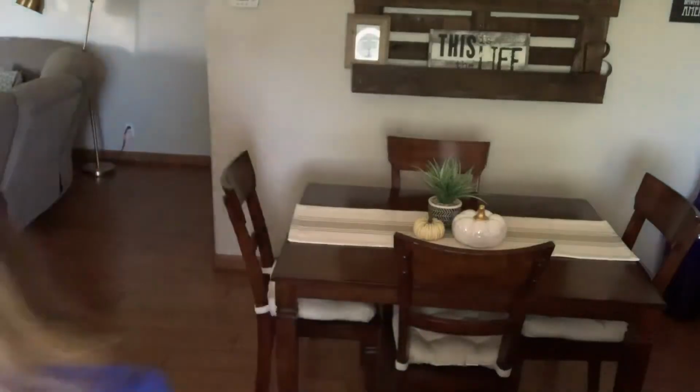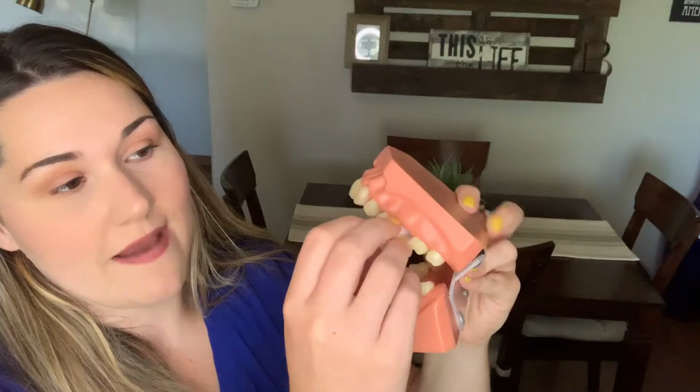And then you'll grab some gauze, you'll fold it up into a little square, and you wanna make sure you have enough so that when the patient bites down, there is pressure into the socket. Which I have paper towels, I can show you guys that. So I'm gonna show you what I mean. I don't have any gauze here, but I do have some paper towels. So you're not gonna fold it up really large, it's gonna be tiny. It's gonna be kind of like this. And you're gonna put this in and you're gonna have the patient bite down on it just to create something to stop the bleeding and to put pressure on that extraction site to help with the bleeding.